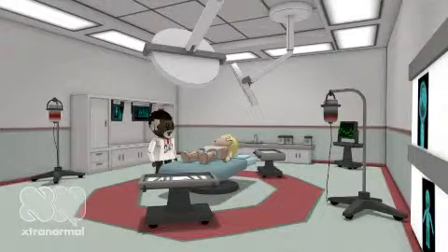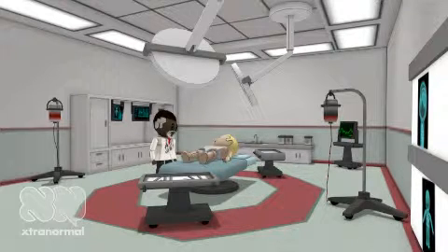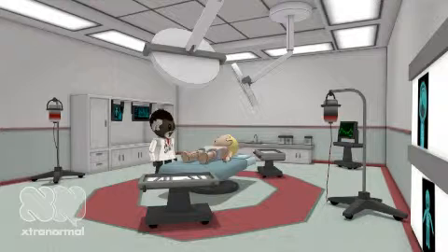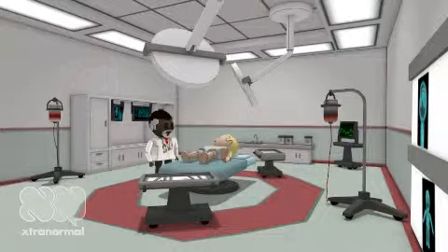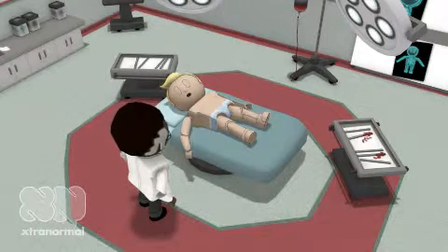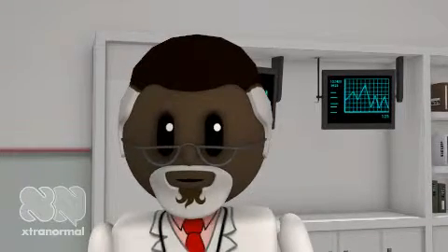Pressure volume loops. In general terms, these loops are looking at compliance. Pressure volume loops also indicate hyperinflation and prolonged inspiration. Normal values for dynamic compliance for a ventilator patient are 50 to 80. The middle line or axis is showing the patient's dynamic compliance. Total lung compliance can be described as a change in volume in relation to the changes in pressure.